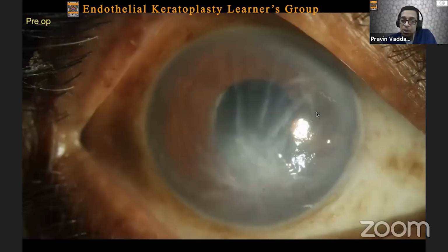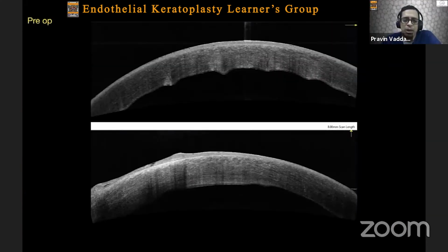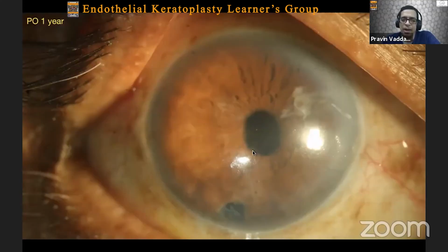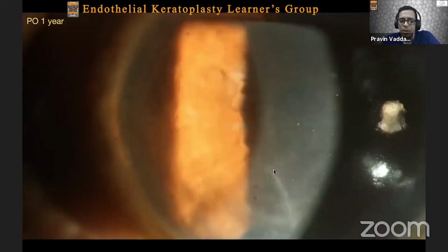There is a subset of patients after PBK who seem to have a localized area of inflammation in the eye after surgery. You will see that they have more superficial vascularization than other patients. When you do the OCT, you can see that there is epithelial reduplication in several areas as well. Post-operatively, this patient did really well, and you will see that the cornea cleared very nicely, including the posterior stroma. But if you look at the posterior stroma more carefully in the area where that patient had the source of inflammation, you will typically see some scarring of the posterior stroma or the pre-Descemet's layers.